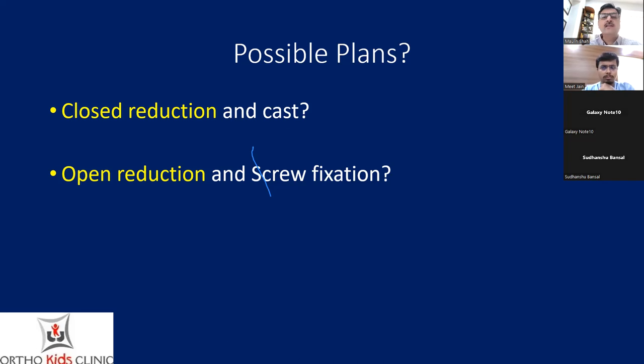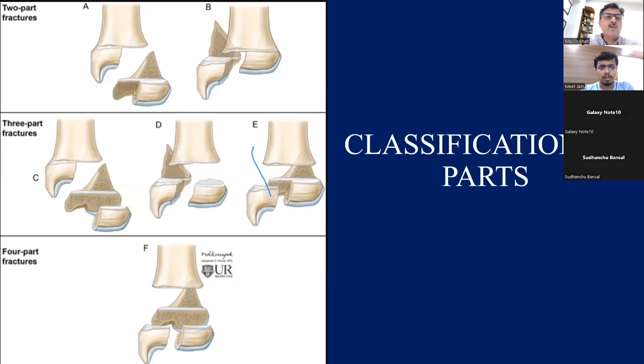So we must fix it. Okay. So, closed reduction and screw fixation is a good idea. Yeah, show what we have done.